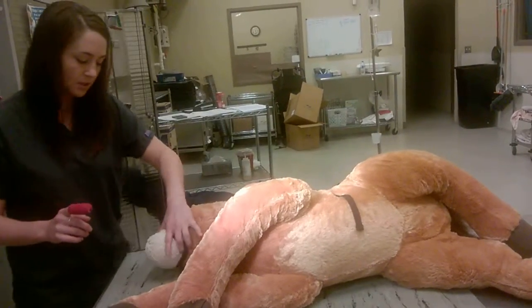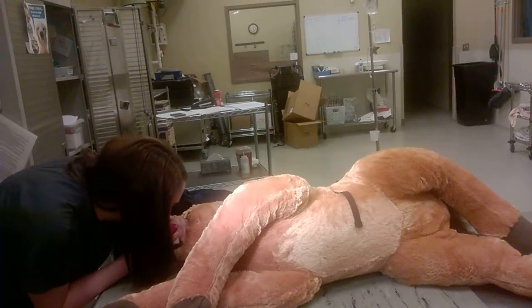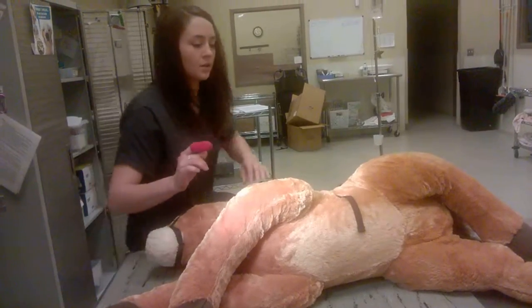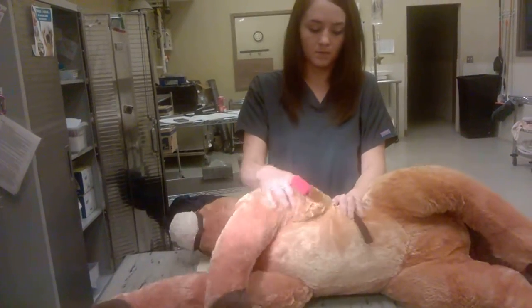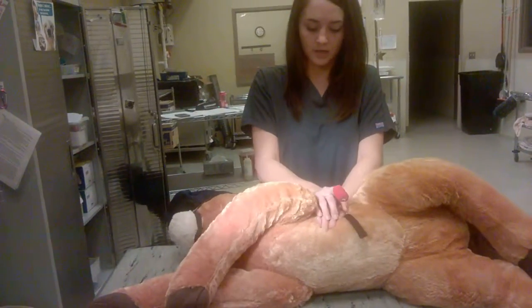I'm going to do two breaths. And we'll do 30 chest compressions, about where his heart would be.